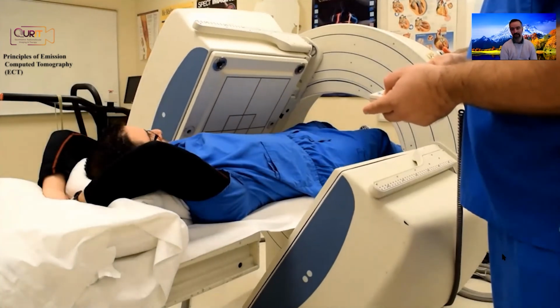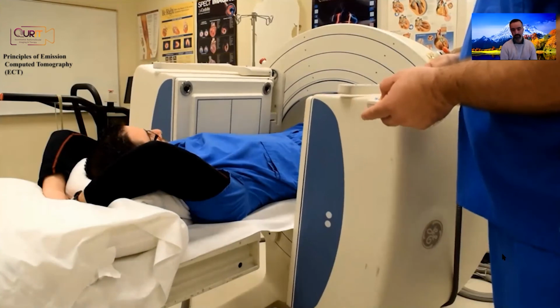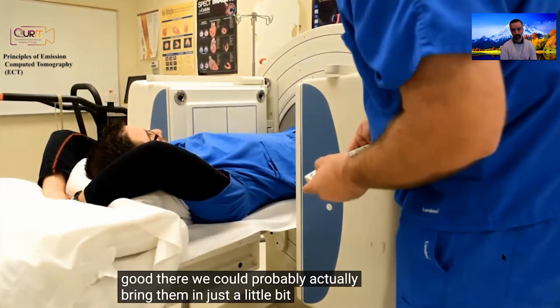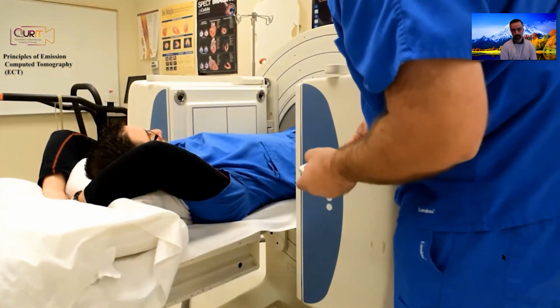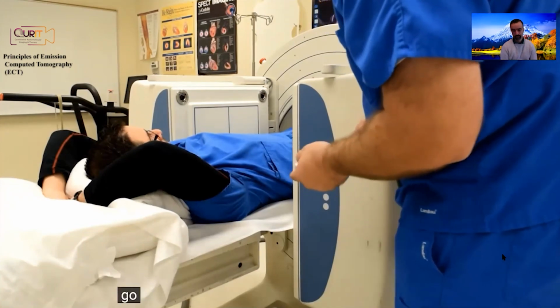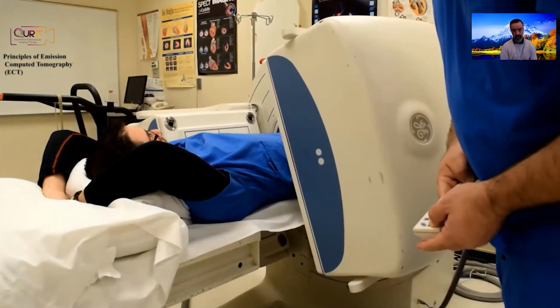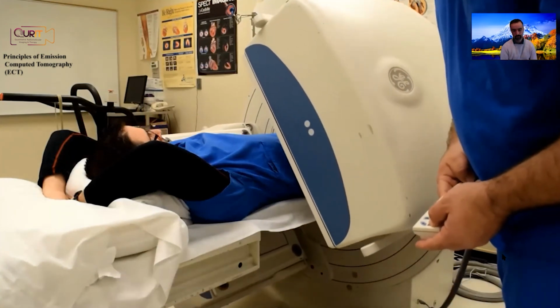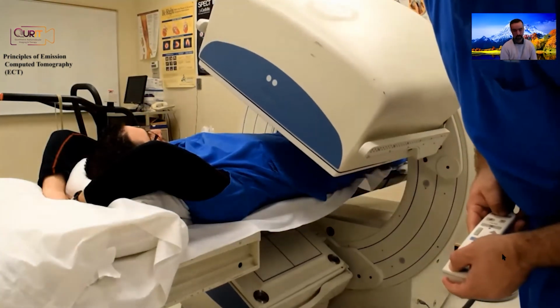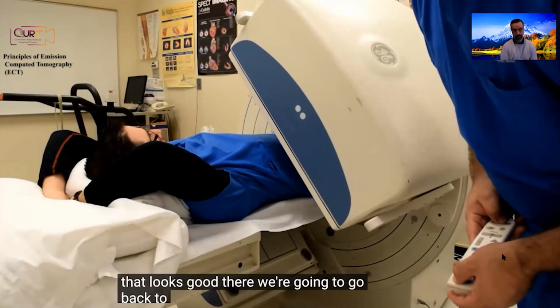So dual head camera, obviously, dual head scanner. It looks like our clearance is pretty good there. We can probably bring them in just a little bit. Okay. Go ahead and keep spinning it, make sure it clears everywhere all the way around them. Okay, looks good there. We're going to go back to our start position.